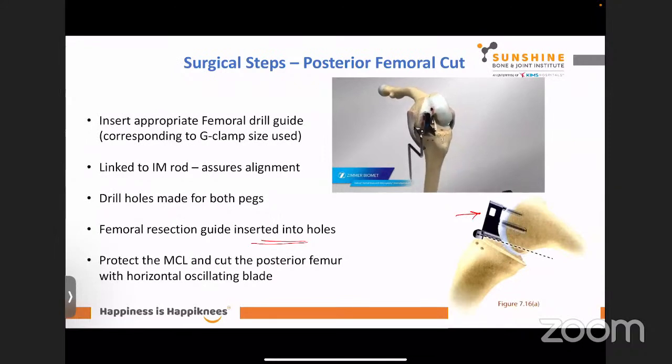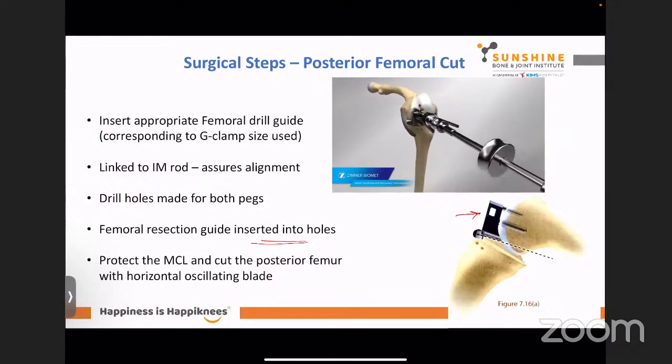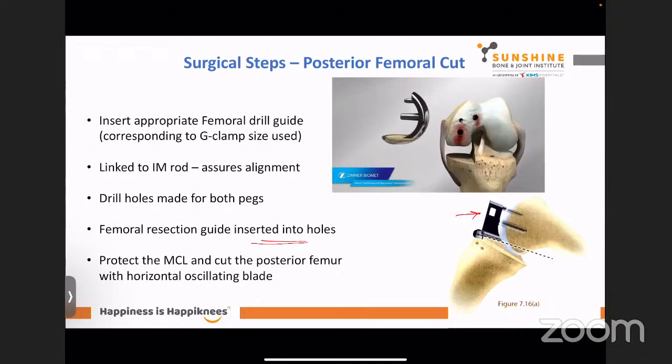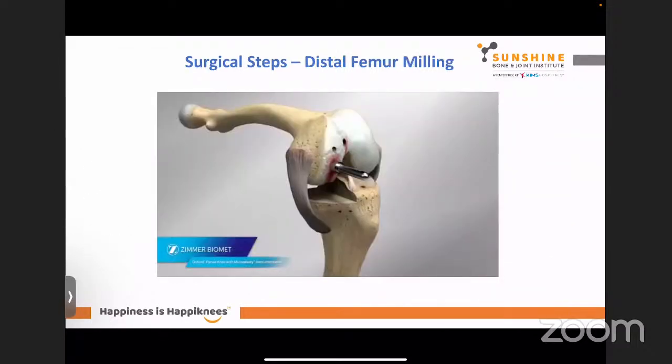Take out your resection guide, the extractor. Then take out your posterior femoral biscuit. Now you have your flexion gap finally created. This amount corresponds to your posterior femoral thickness. Okay? So now you do something called a distal femoral milling. So now you have a flexion gap. You need to create an extension gap, just like a TKR.